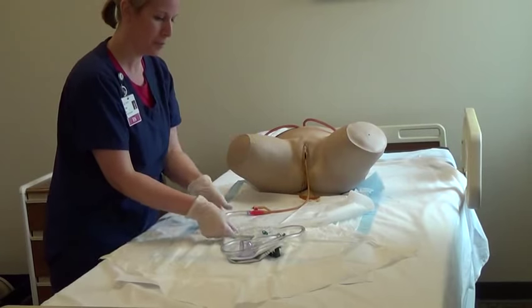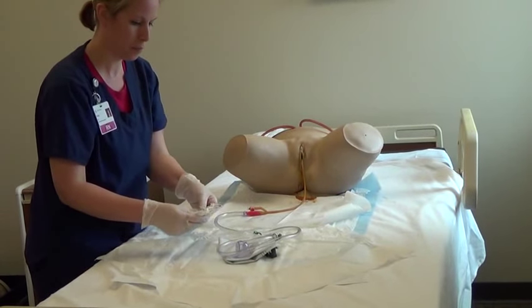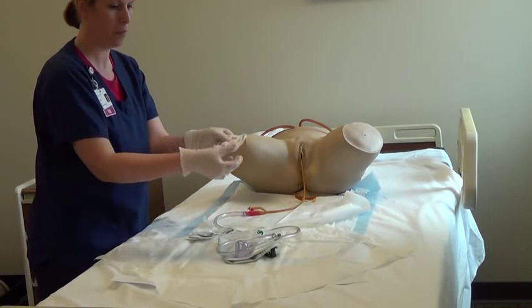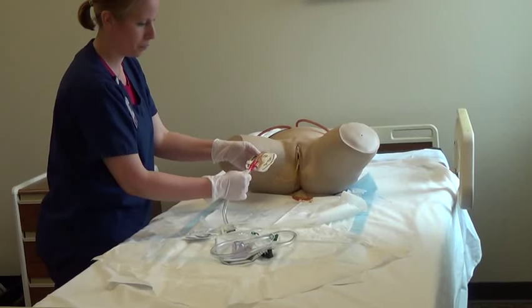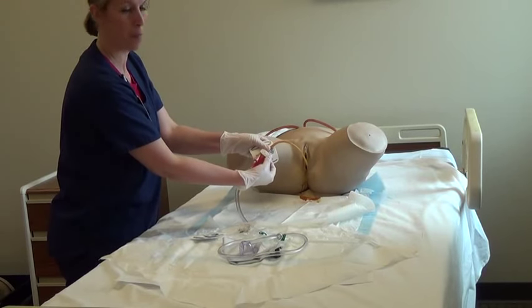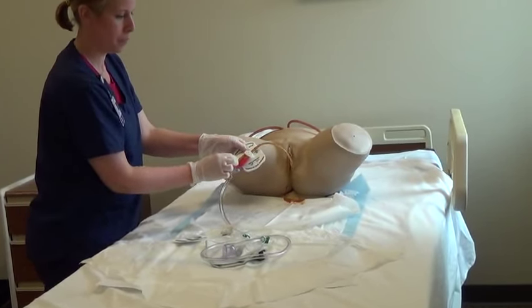Place the Foley catheter into the Statlock retainer first. Directional arrows should point towards the catheter tip, and the balloon inflation arm should be next to the clamp hinge. Close the lid by placing your fingers under the pad and pressing the grip markers at the end of the clamp with your thumb, being careful to avoid pinching the catheter.